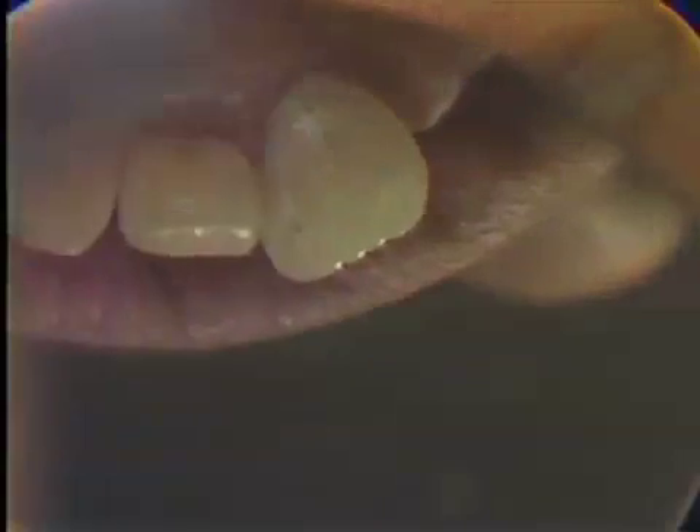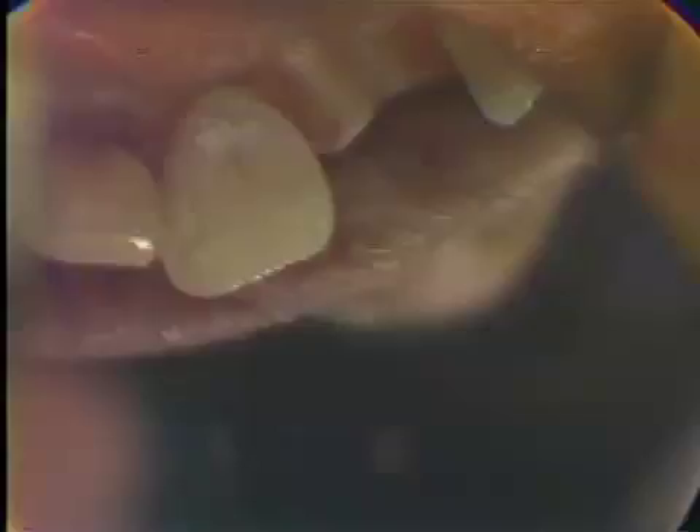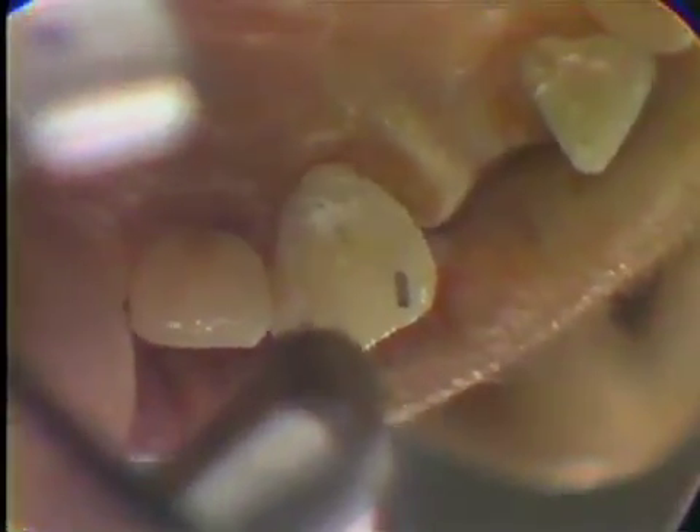Then we move the same twist drill over to the next pinhole and by establishing the line of draw on the first pinhole, we're going to drill the second one. We're going to use the impression pin as a guide pin. This is not very difficult but it's very important — do a dry run. Line up this twist drill with the guide pin from two directions: from the anterior and from the distal. Do this back and forth until it looks like both cuts are going to be in the same line of draw.